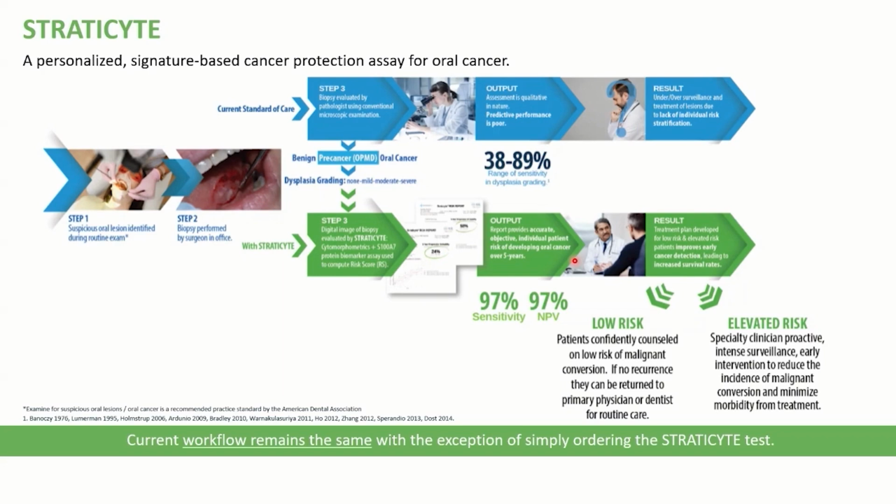Most of you should be aware that tissue block remains in a pathology practice for years. If it's an academic institution, typically it's decades and decades because that's research material, right? All you have to do, even for retrospective cases, is go back and say, we're going to order this test on this patient that I saw 2 years ago, 5 years ago, 7 years ago. It is more likely than not that the lab has that tissue and it can be sent off for this protein overexpression, because everything is formalin-fixed and paraffin-embedded. So this is something that can be utilized not just prospectively, but also retrospectively for a lot of patients that we see in our practice.